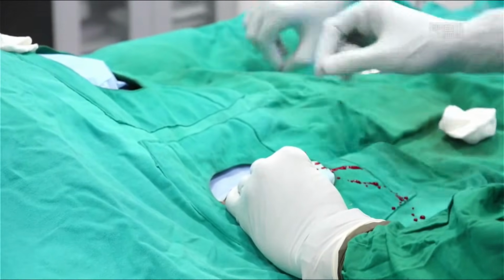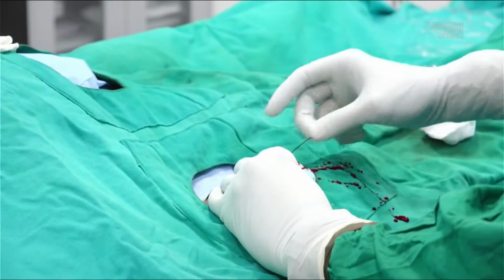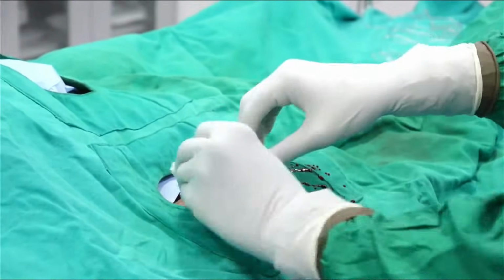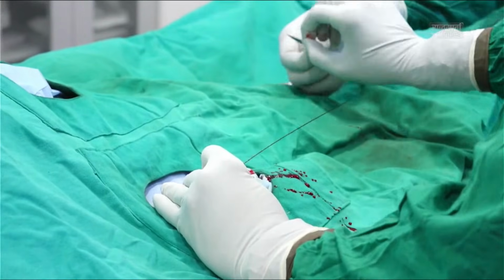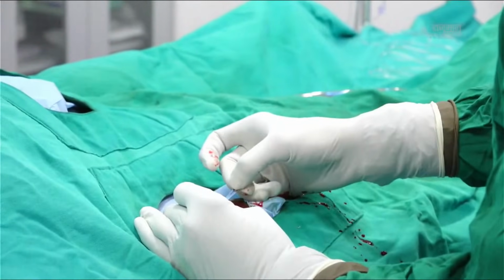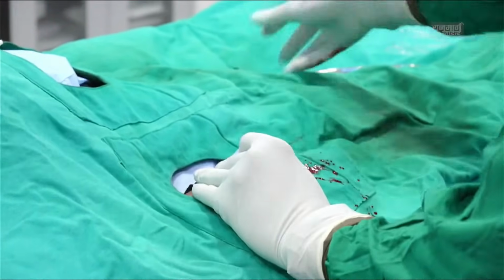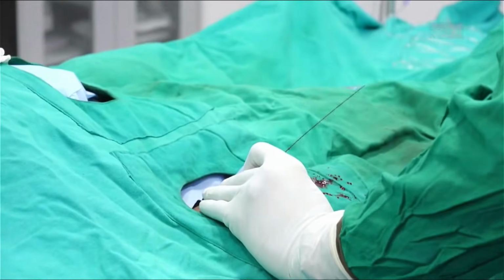This is arterial blood. It is pulsating red blood, and we are sure that we are in the right position. Then we will take a blade to widen the opening so that the sheath goes in easily. Sheath.